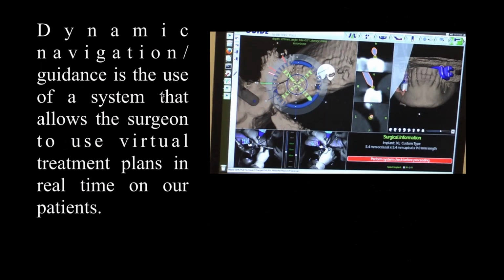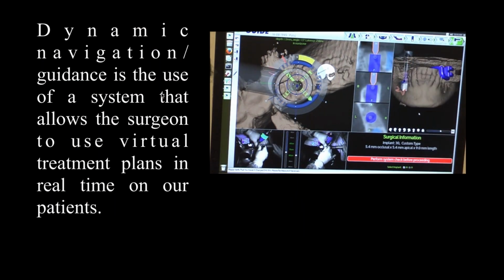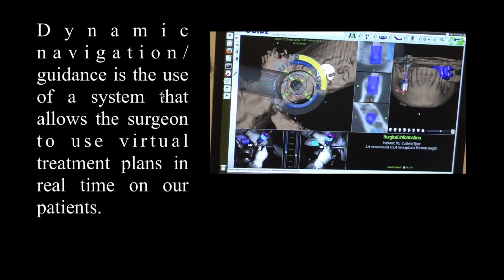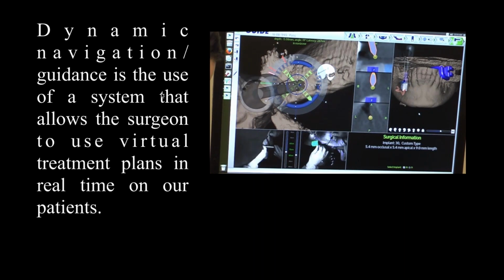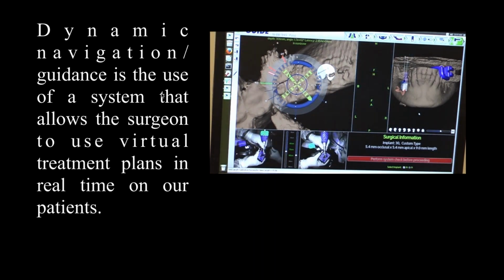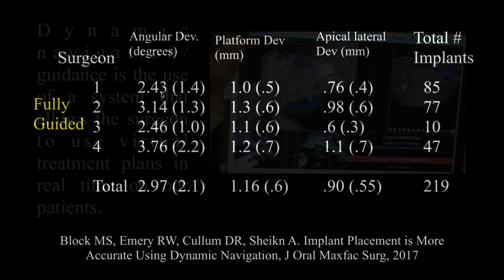Now, what we like to do when you place the implant is to see the navigation. The navigation that's done is real simple. We're looking at the screen and we'll put the implant in. You see the yellow is depth and the handpiece. And I'm looking at the screen when I'm putting this in. So it's a live interaction between the patient and my drill. And by doing that, I can navigate the system very accurately. This is just like tracking software you'd see in the hospital, or you'd see the Air Force does with bombs and rockets. So it's a very effective way of doing things.